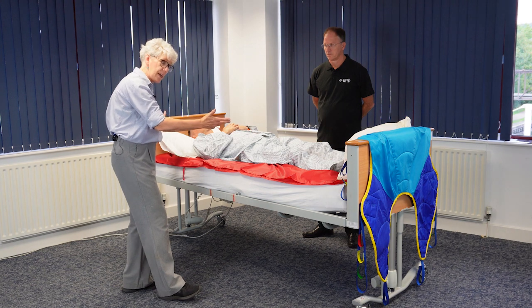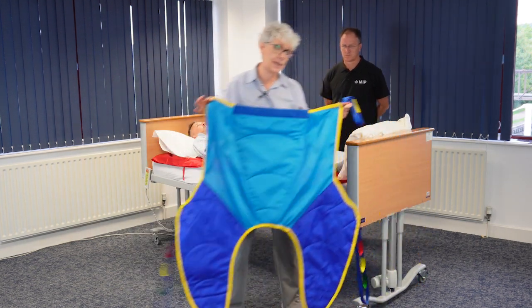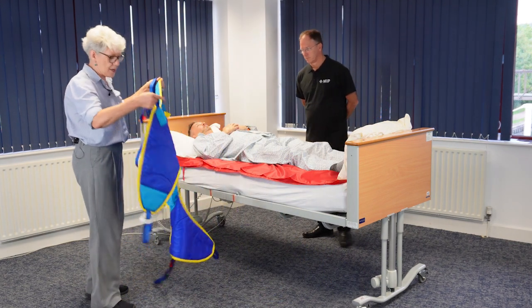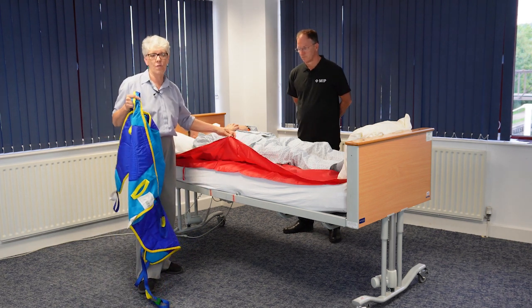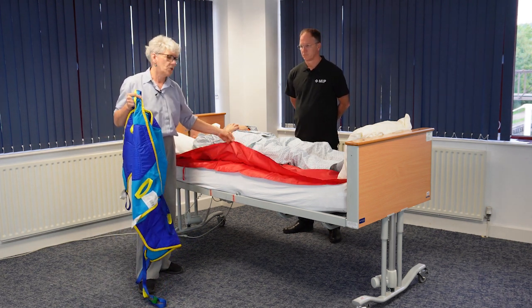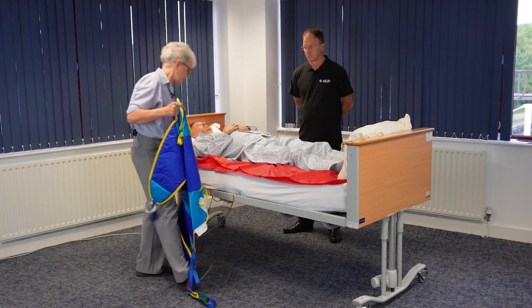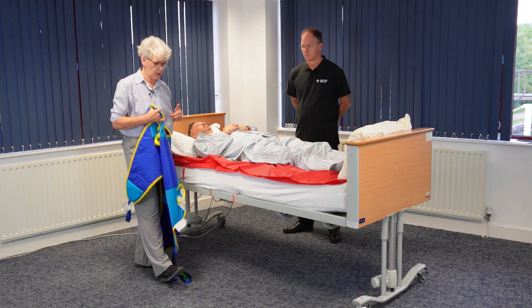The slide sheet is in place. We're using a divided leg sling and I'm going to position the sling in between the two layers of the slide sheet. It's important when you're positioning the slide sheet to make sure that the open edges of the slide sheet are along the sides of the patient.